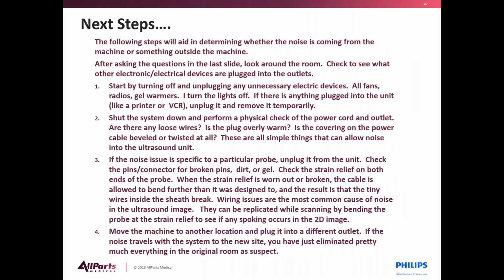The following steps will aid in determining whether the noise is coming from the machine or something outside the machine. After asking the questions in the last slide, look around the room. Check to see what other electronic or electrical devices might be plugged into the outlets. And that's where I start.